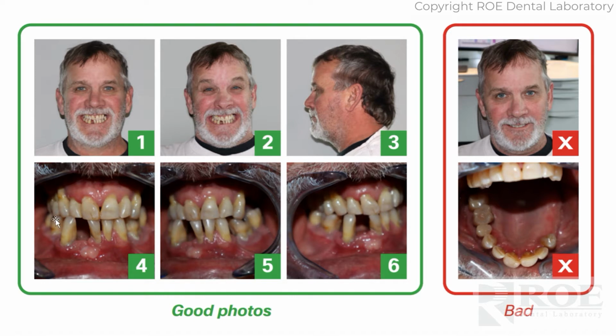And it's important to have the patient in their normal bite so that we can make sure the case is articulated correctly. We want a regular smile. We want an exaggerated smile, and then profile pictures. Generally, if we're dealing with a class 2 or class 3 situation, we want a profile, but you can always send a profile. And then we do not need any photos of occlusion. We do not need any ortho photos, just the photos on the left. And then just try to have the patient looking directly at the camera and a more exaggerated smile and centered.